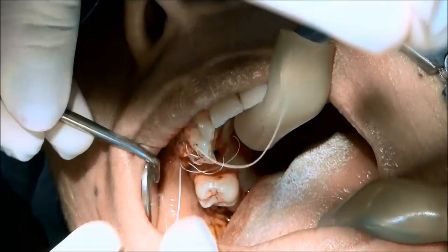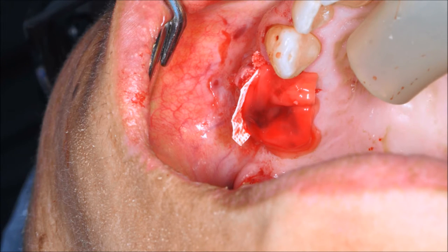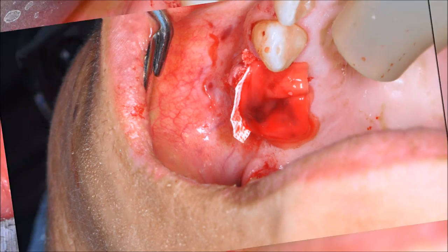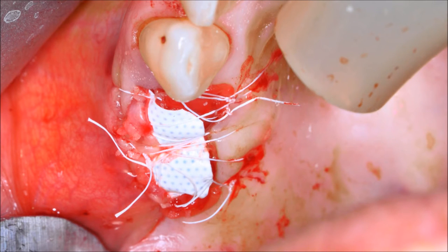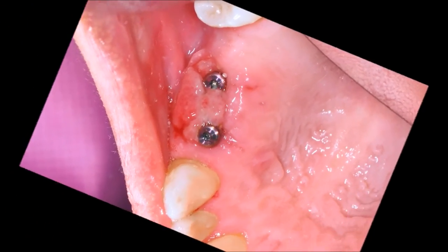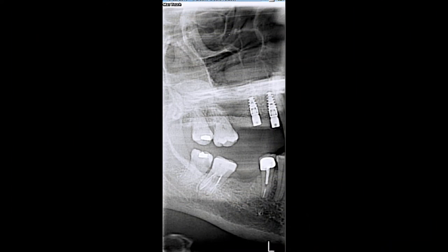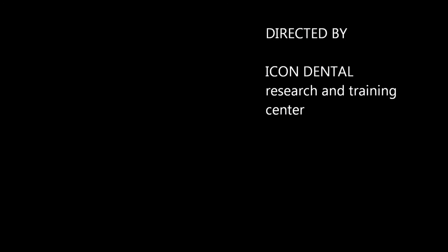Placing here the final suture. This picture shows the double membrane and double protection, and this is a picture of healing after one week. This is a screenshot of the x-ray we took the same day of surgery. Thank you very much for watching — please give us a call or email us if you have any questions. Thank you very much again.